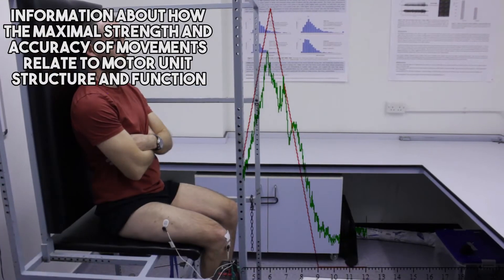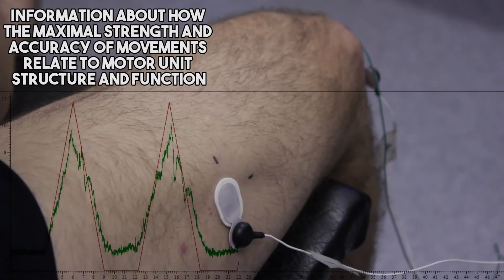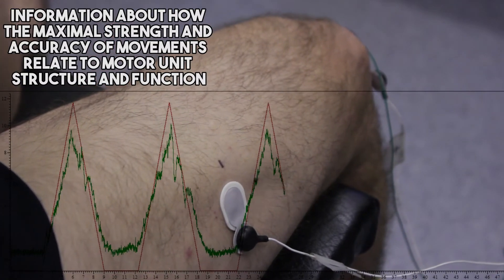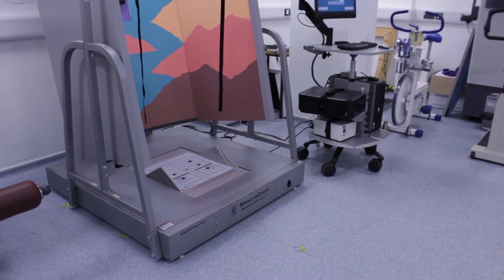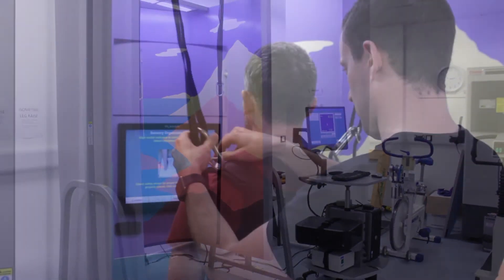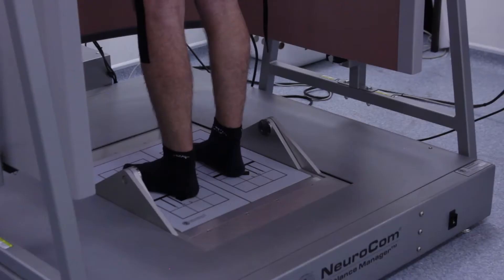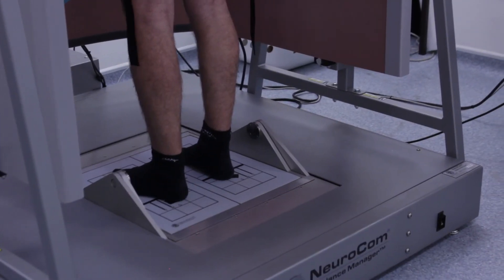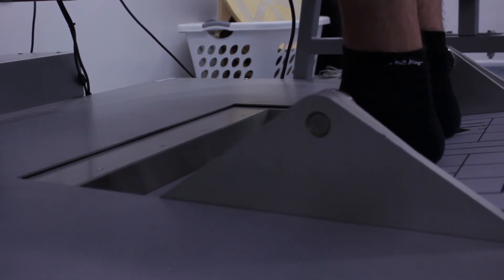The assessments completed here provide information about how the maximal strength and accuracy of movements relate to the motor unit structure and function. In more advanced tests, we can use this information to understand how people are able to stand upright, balance and complete normal daily movements.